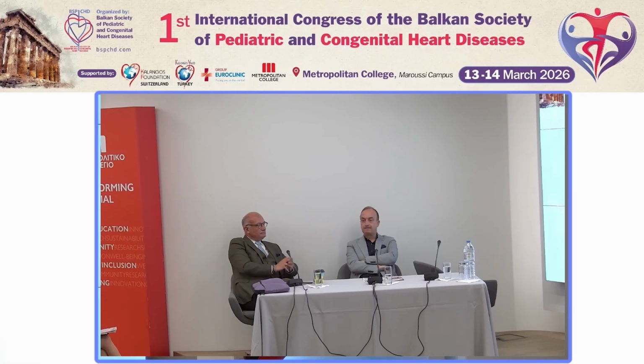You're absolutely right. This is the forefront of the valve assessment. The CMR remains the gold standard in volumetry, in quantifying the volumes, the stroke volume, the forward volume, and unfortunately echo cannot achieve this level of reproducibility. So it is reproducibility and correlation with anatomical models that CMR is the gold standard for, not the whole of the valve assessment.